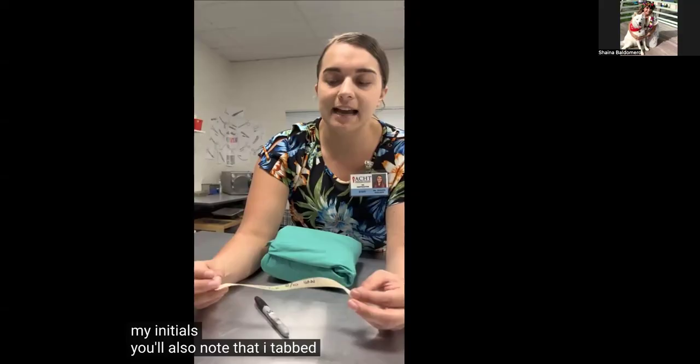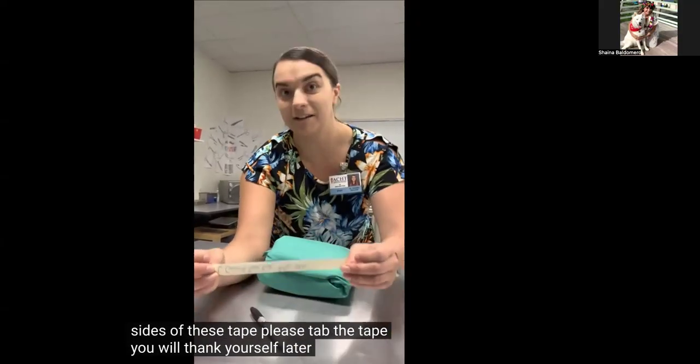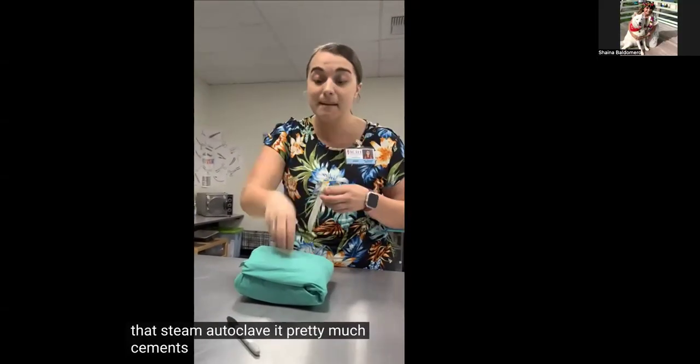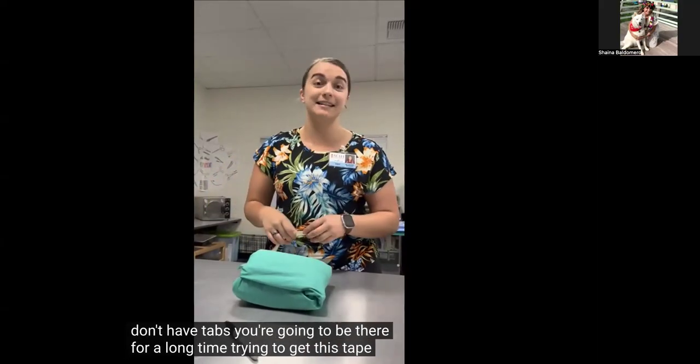You'll also note that I tabbed both sides of the tape. Please tab the tape. You will thank yourself later. When we put this pack and tape through that steam autoclave, it pretty much cements it onto this pack. So if you don't have tabs, you're gonna be there for a long time trying to get this tape off.